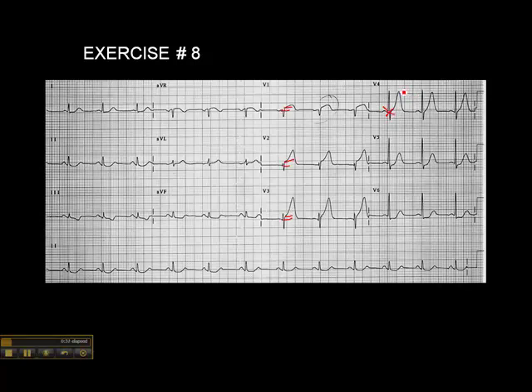What we do have is what appears to be hyperacute T waves. You'll recall we talked about those in a previous presentation — if you have really tall, rounded T waves, unlike the tall peaked T waves we see in hyperkalemia, that may be suggestive of MI. So we don't have ST elevation there, but we may be headed that way.